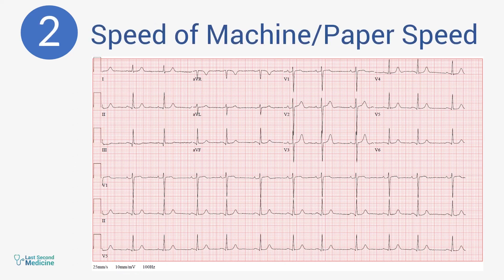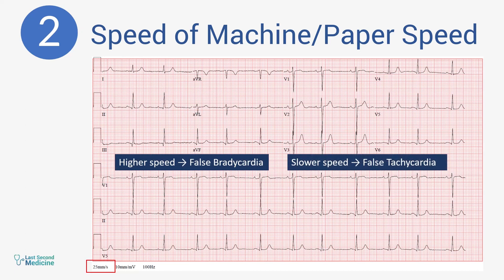Number two: speed of the machine. 25 millimeters per second is the standard speed at which an ECG is recorded. The recording speed is printed on the ECG. If the recording speed is more than this, the waves will be farther from one another, and vice versa. This can make you interpret erroneously bradycardia or tachycardia while the patient looks otherwise stable and the measured pulse is also normal.